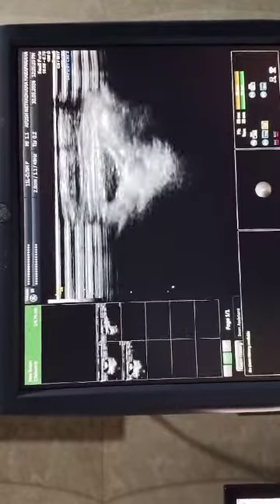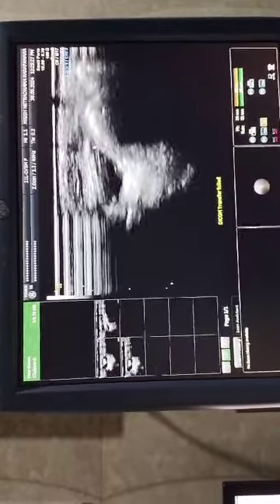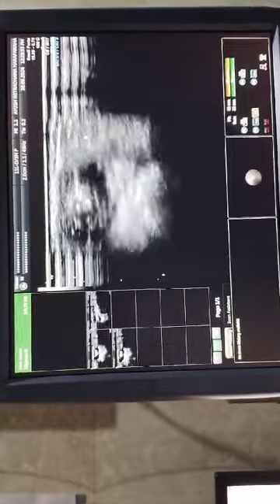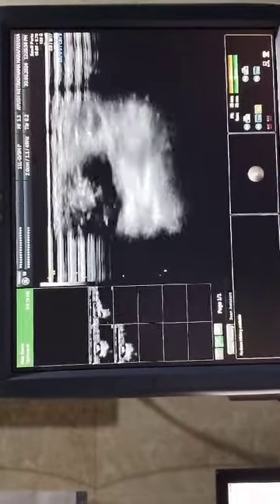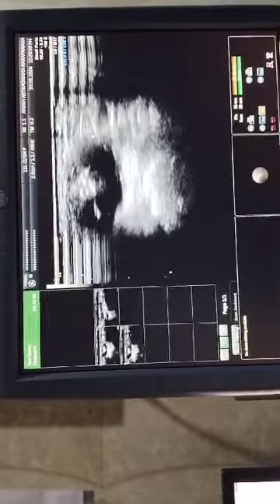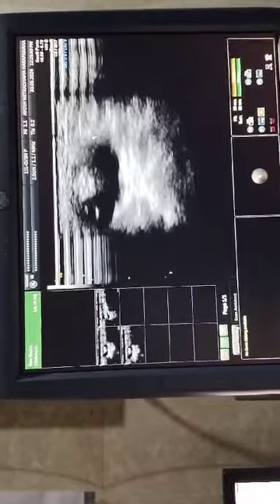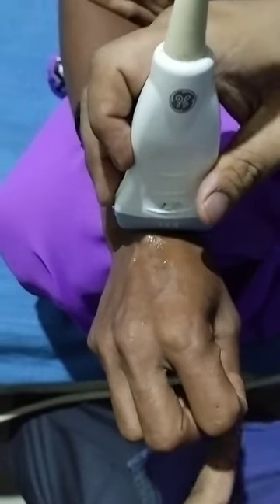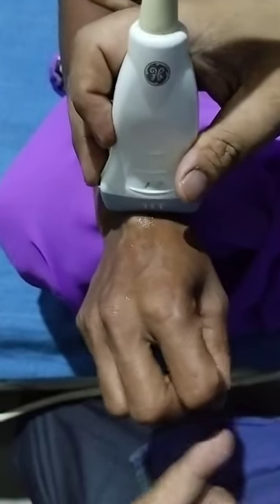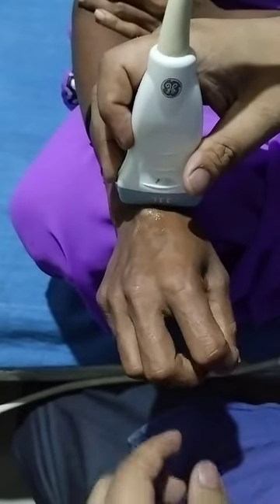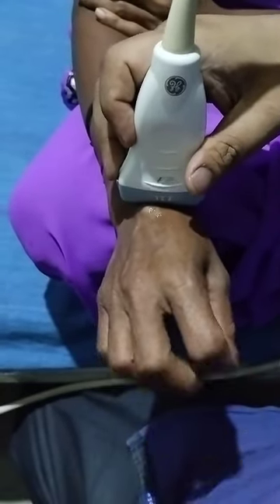When she moves the extensor finger tendon, the tendon moves — this is dynamic sonography. The patient complains of difficulty of movement of the index finger. You can clearly see the movement of the index finger is less as compared to the rest of the fingers.